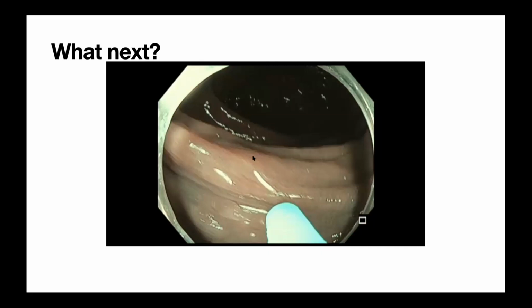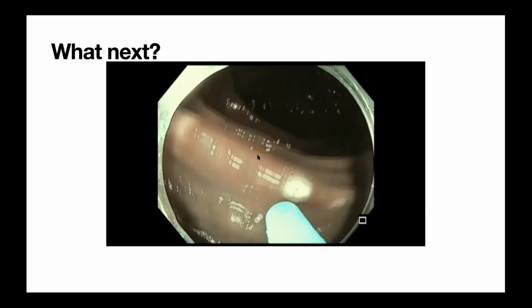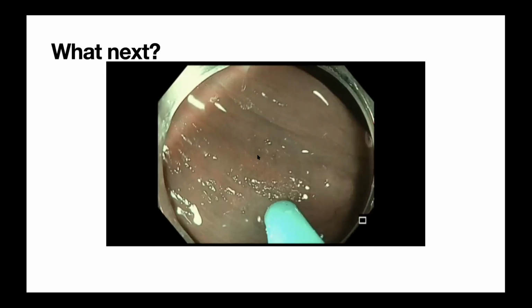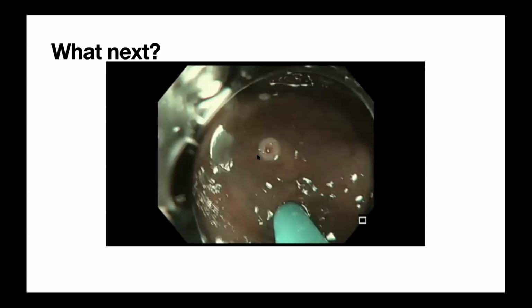So we saw this large lesion, and when you see a large lesion, I think Roy would say, why not put some chromoendoscopy? That, I think, would have been a good idea. But what we did was we decided that, okay, we're going to resect. And I didn't want to just resect without defining the border. So we used an APC to define the border. As you can see, it is so subtle. And we used a PD scope. I wish I used an adult scope. Because of our previous surgeries, I felt that a PD would be easier to do.